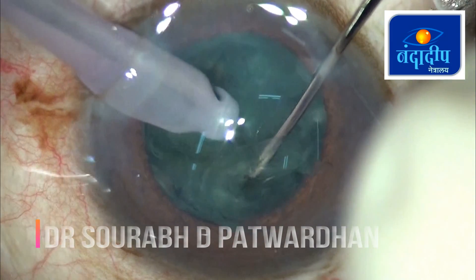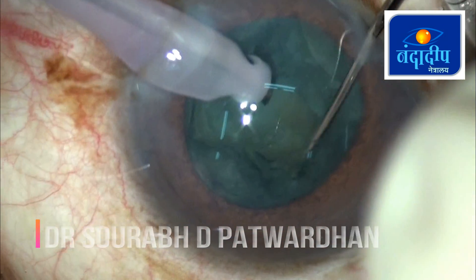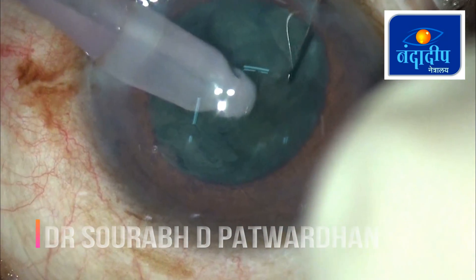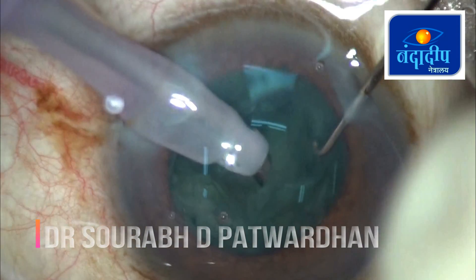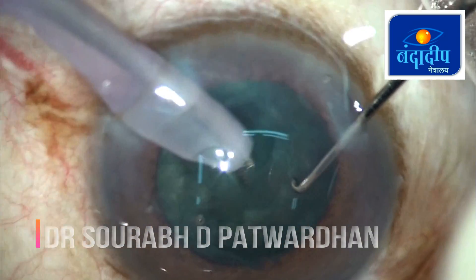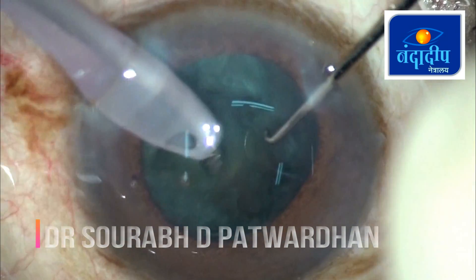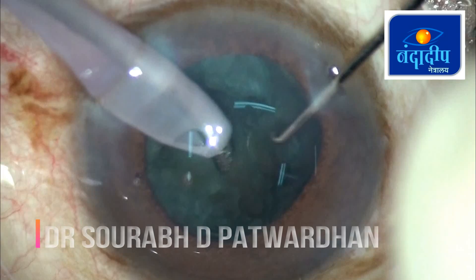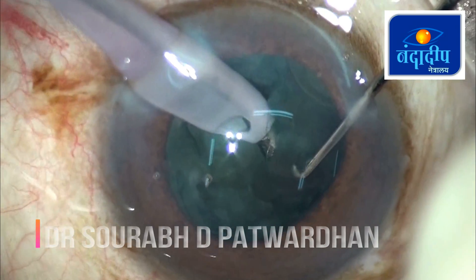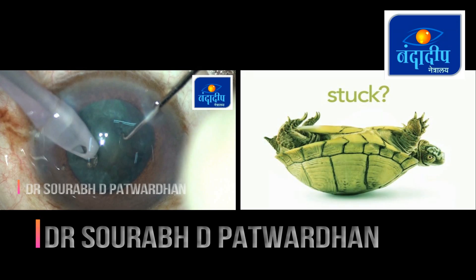So this is how we create a bowl — not enough trench, it is not deep. The surgeon feels that he has divided the nucleus but in fact it is only partially divided, and then the surgeon tries to take out the piece from the bag and this is what happens. You keep chipping parts of nucleus but the nucleus doesn't come out of the bag, and when you keep rotating and chipping away these pieces of nucleus you end up with a bowl, and then the surgeon obviously feels stuck.